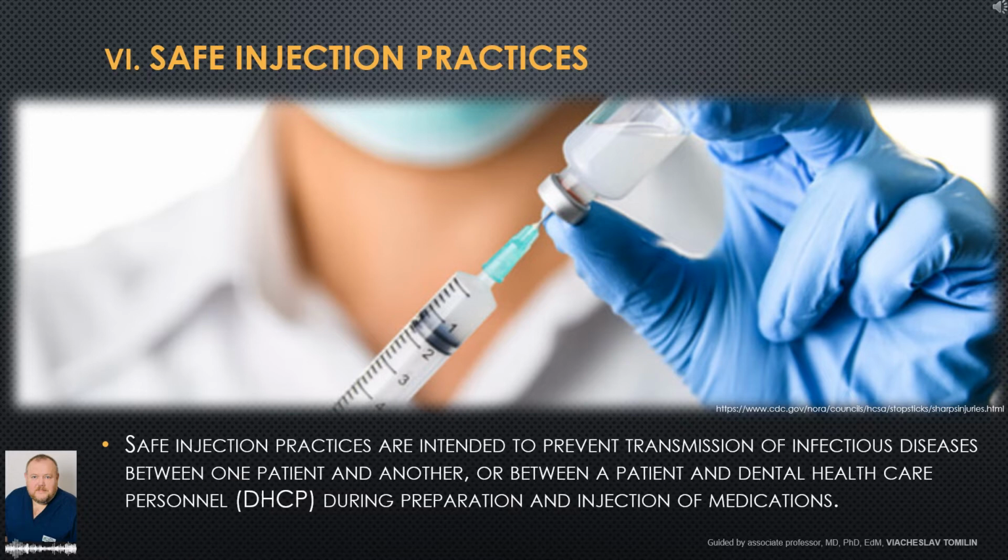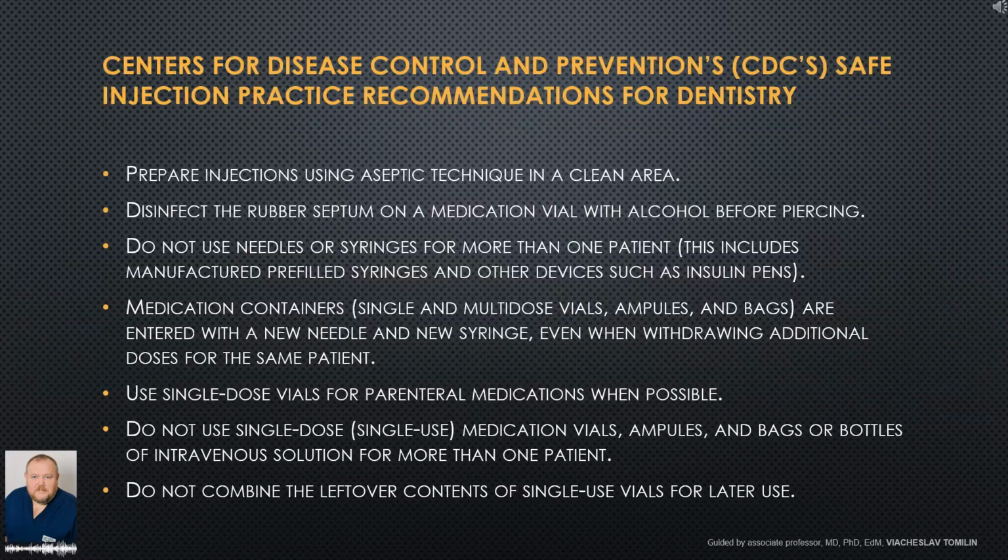Dental health care personnel most frequently handle parenteral medications when administering local anesthesia, during which needles and anesthetic cartridges are used for one patient only, and the dental cartridge syringe is cleaned and heat sterilized between patients. Other safe practices apply to use of injected medications and fluids, such as for patients undergoing conscious sedation. A safe injection does not harm the recipient and does not expose dental health care personnel to any avoidable risks.